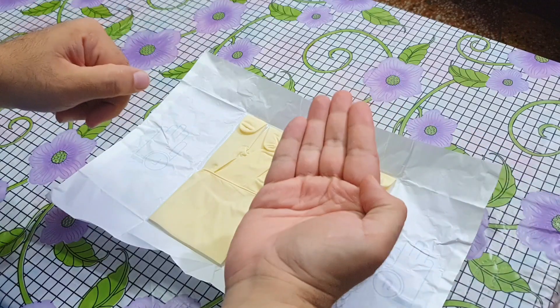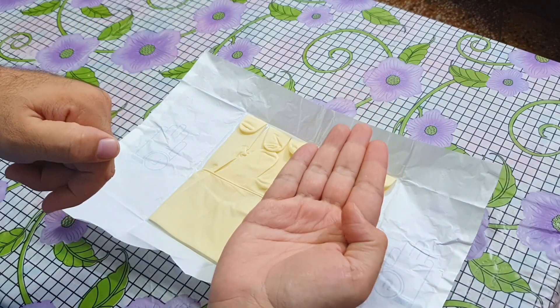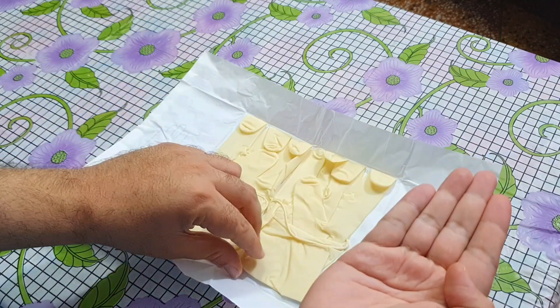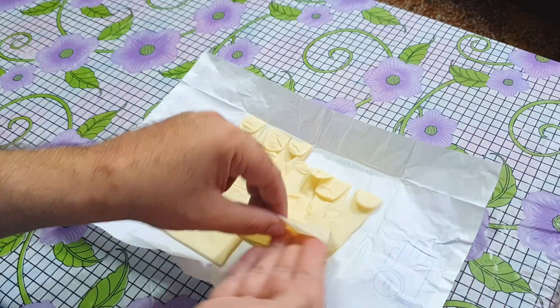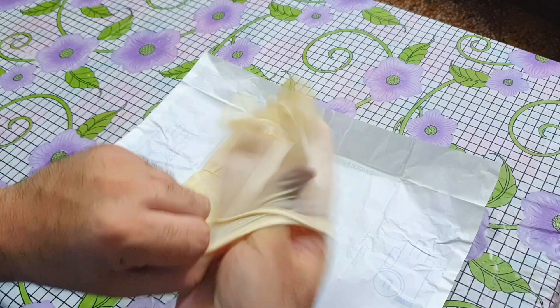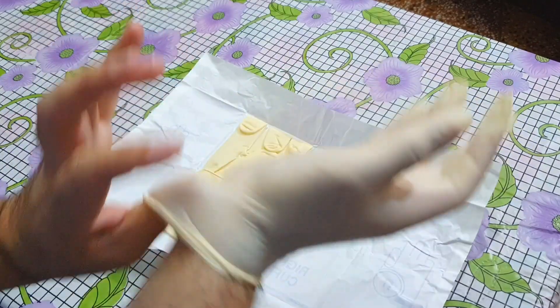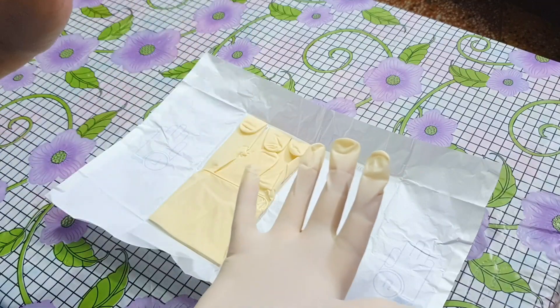First of all, make your dominant hand in this position — mine is right, so I have made my right hand in this position. Its fingers are close together and the thumb is flexed. Now hold the glove from the folded part without touching the outer surface and slide your hand in slowly. When you reach near the fingers of the glove, manipulate your fingers so that they slide in properly. See — I am not touching the outer surface. The little imperfections seen can be corrected later on.